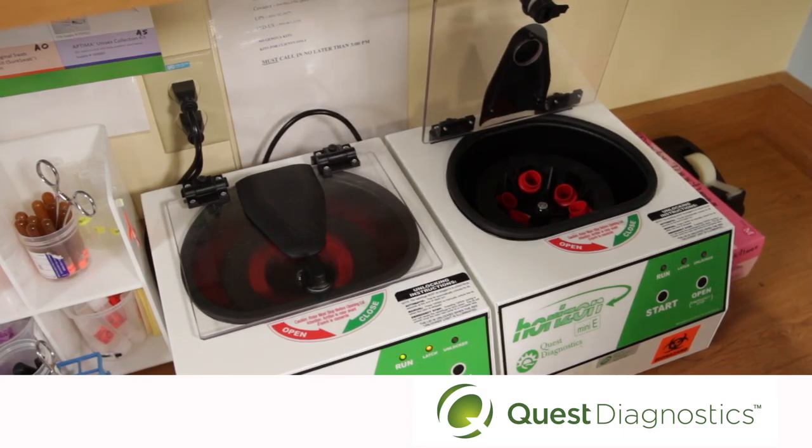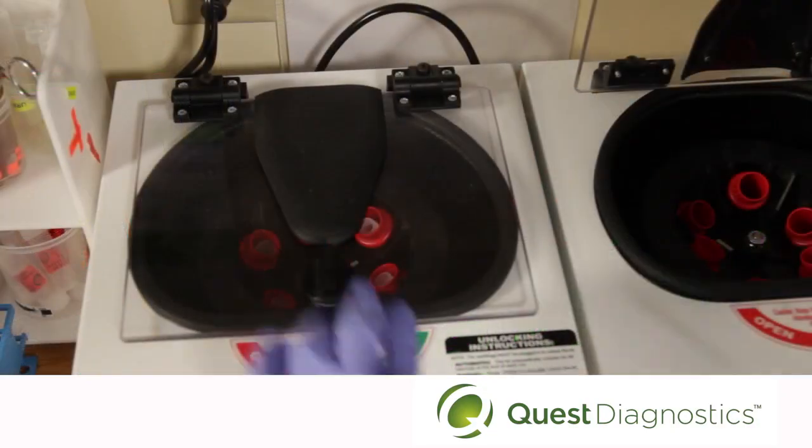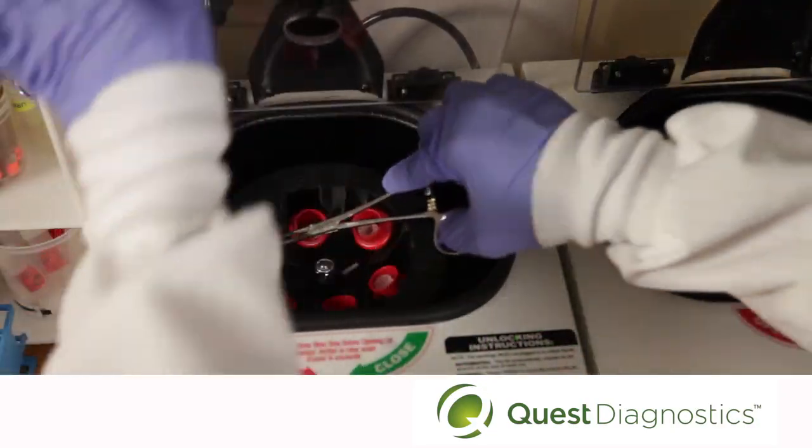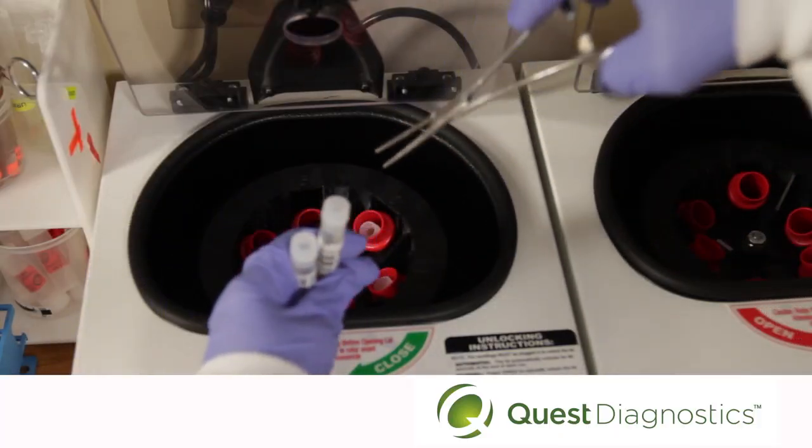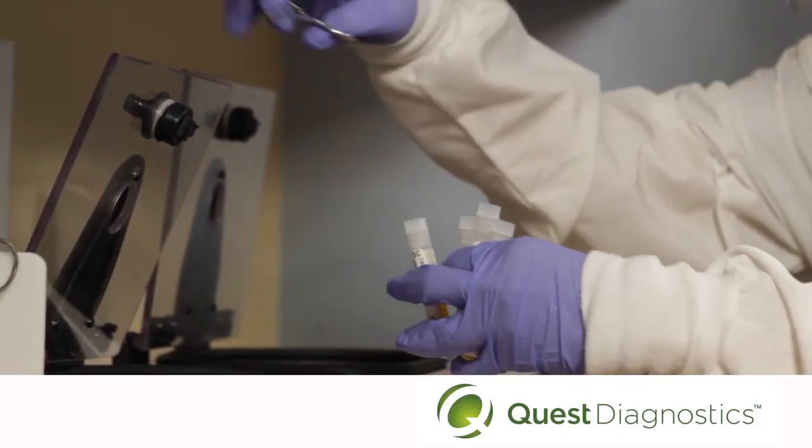Again, ensure tubes are balanced in the centrifuge. Once the tubes have spun for 15 minutes at 1500 G, carefully remove the tubes from the centrifuge and place in the rack.